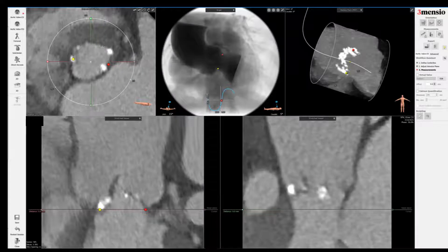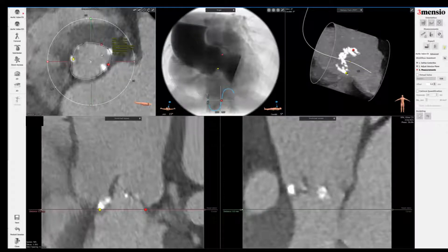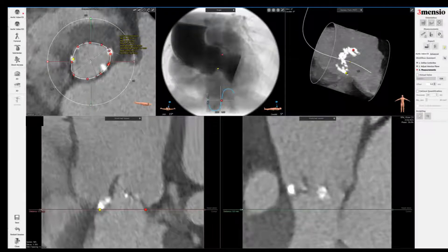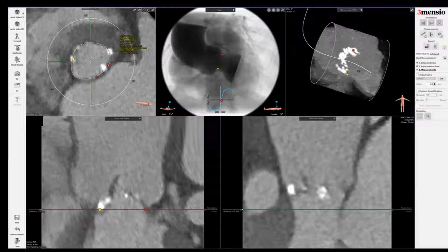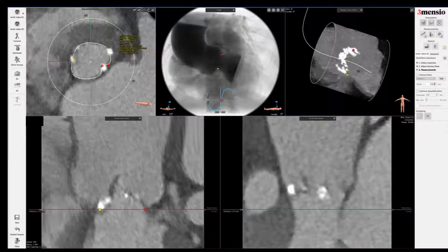Let's measure the annulus with the lasso tool — trace around the annulus here, making sure you include the contrast portion only. I typically trace across the calcium because if you go outside it, you overestimate; you can see it's 381 rather than about 373 in area. Similarly, if you go inside the calcium the perimeter goes up to 70.9 rather than 69.2, so you might overestimate the perimeter and unknowingly reduce the area.